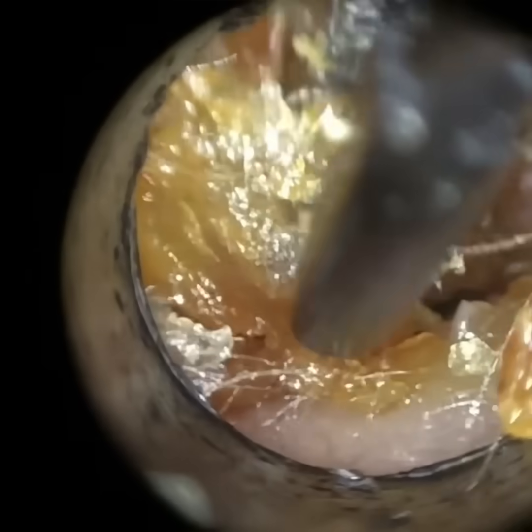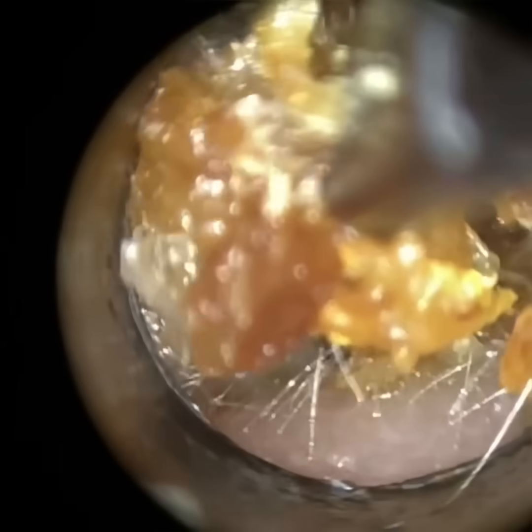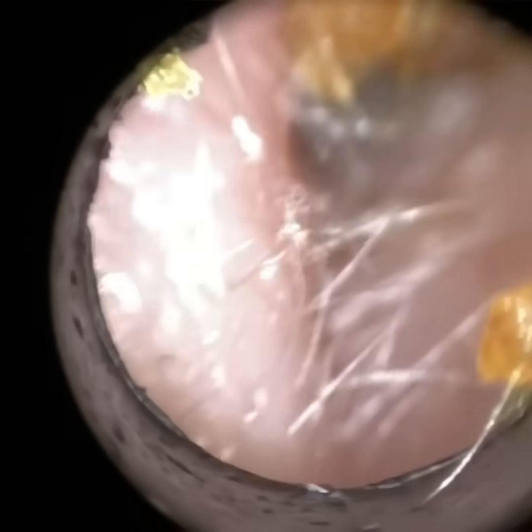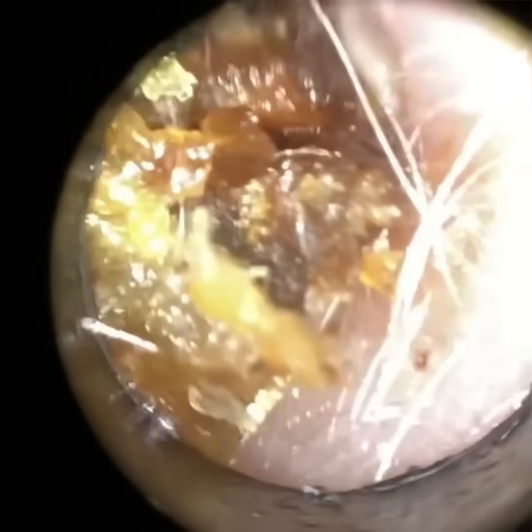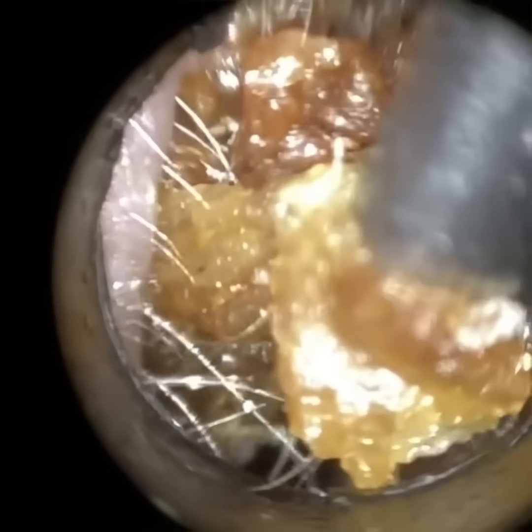So again, I'm just stretching the ear, and that's where it's a lot easier to do with the speculi compared to the endoscope. A lot of people struggle stretching the ear with the endoscope. But with the speculi, it's like a funnel, so you can insert it into the ear. It's still not easy to stretch and dilate, because you've got to be careful you don't make contact with the second bend of the ear canal. So you can go into the ear where it's cartilage, and then you're having to straighten and manipulate the speculum, and it's then quite easy to bump into just past the second bend, which is the bony part. So there is a skill involved there as well.